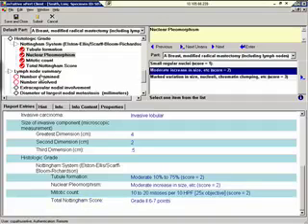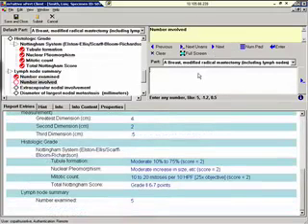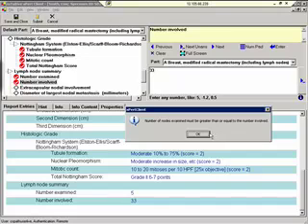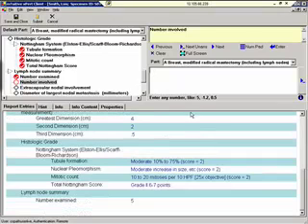Let's move on to the lymph node summary. Number examined, 5. Number involved. If I accidentally type 33 here instead of 3 and click Enter, we get an alert message advising us that the number involved must be lower or equal to the number examined. We'll click OK to acknowledge that message. This is another example of how xPert prevents unintended errors. We'll enter 3 and click Enter.